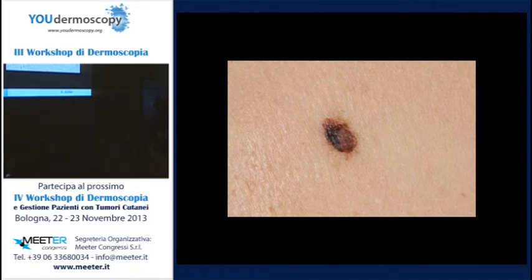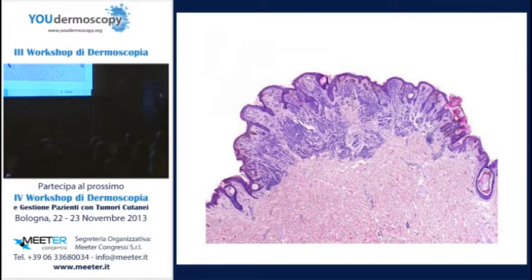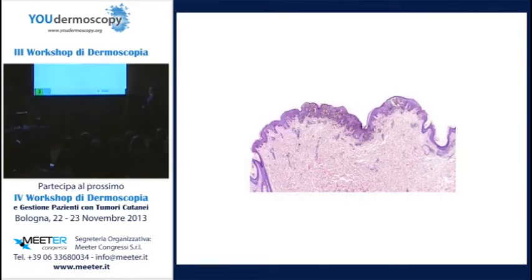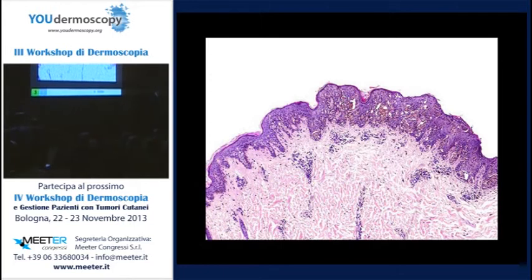Here's the melanoma in the nevus, and if you cut it here, you see a nevus that Jerry, when I asked him, called a very typical nevus, not dysplastic at all. You see, if a melanoma develops in this nevus, it must not develop in a dysplastic nevus. Most often, it develops in a completely inconspicuous nevus. And here you see the melanoma, obviously, that developed in a completely inconspicuous, non-dysplastic nevus.